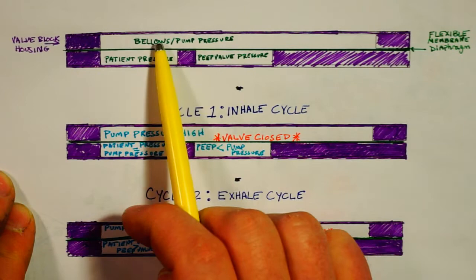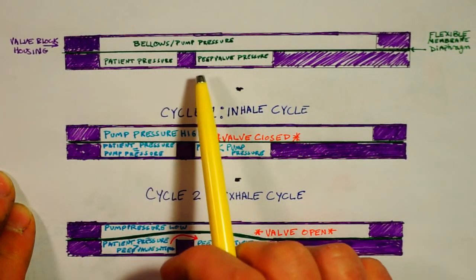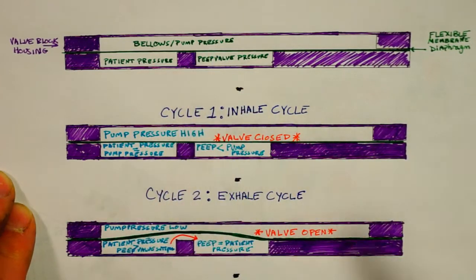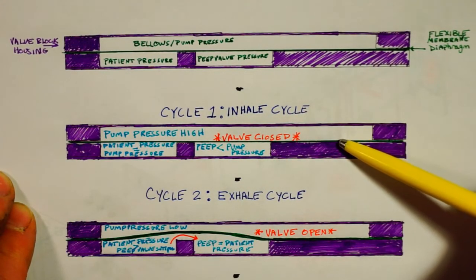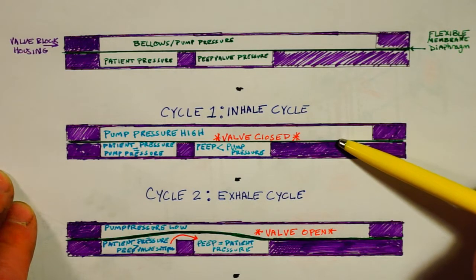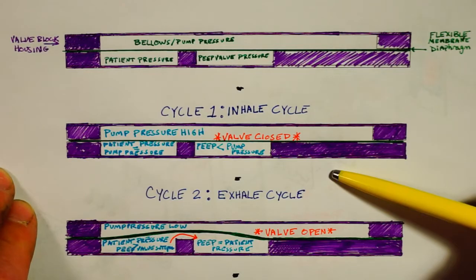And that applied voltage will either expose the collector and the emitter to each other, or not. And I just thought that was an interesting little thing. And in fact, the cross-section of the actual device, which this is, looks a whole lot to me like the SEM images of a transistor or a MOSFET. Just something interesting I thought I would point out.